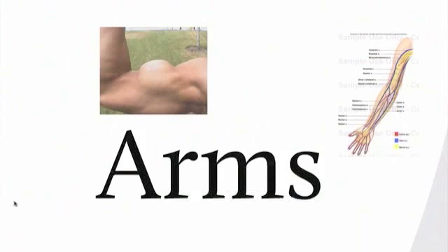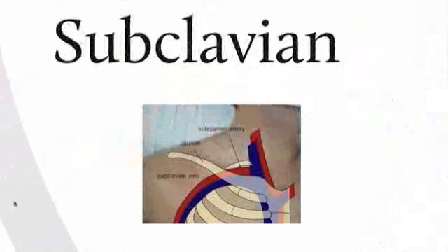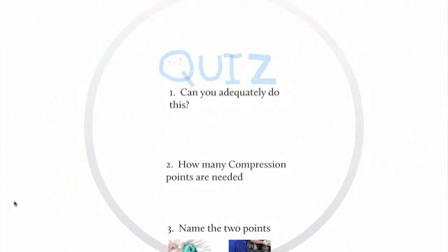Also, subclavian is another place where you can have clots, and another quick place just to mention is the iliacs, a place where you could definitely have deep venous thrombosis that is at high risk of embolization. The upper extremities aren't at as high a risk of embolization. So, despite the data that we have that we're very good at ruling out DVT in the lower extremities, if you've got a high pretest probability in your patient population and you've got a negative bedside ultrasound, that doesn't necessarily mean you're completely done. If you really think they've got it, then you probably need to look at their iliacs.